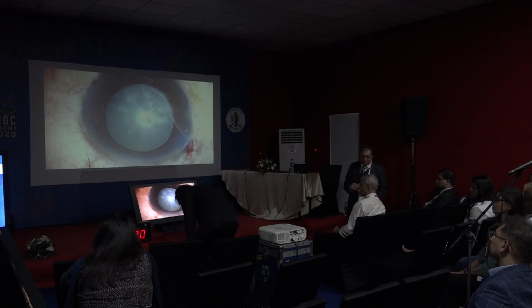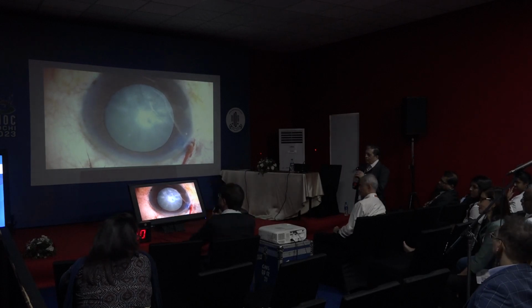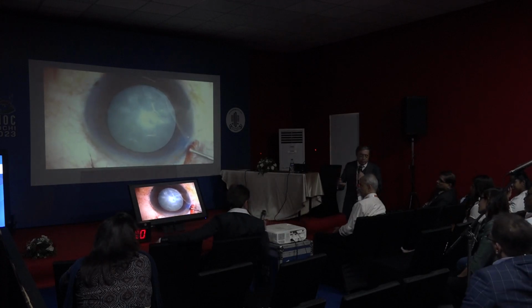Okay. Do you use micro scissors anytime? Yeah, if it is going to the periphery. No, even in this aspect also. Fibrotic, yes. And in fibrotic, some people have even used a vitrectomy cutter just to cut it off.